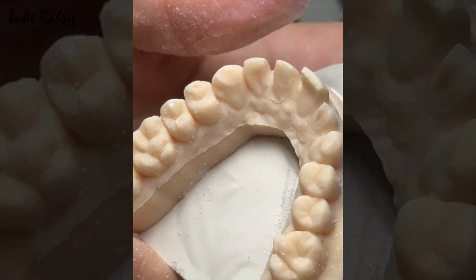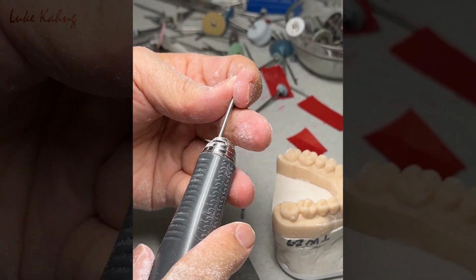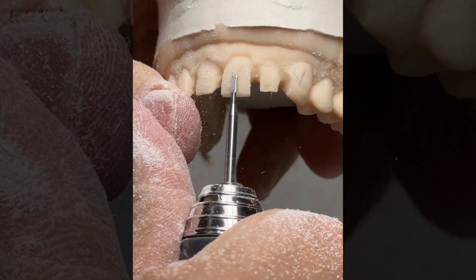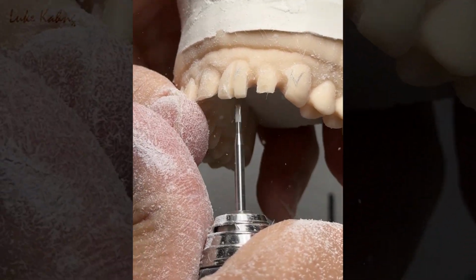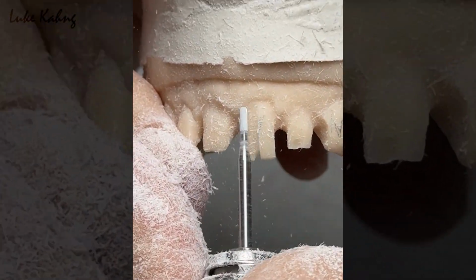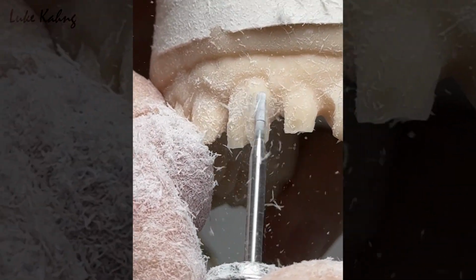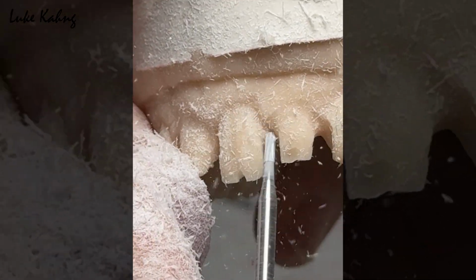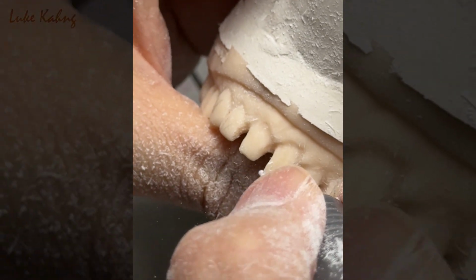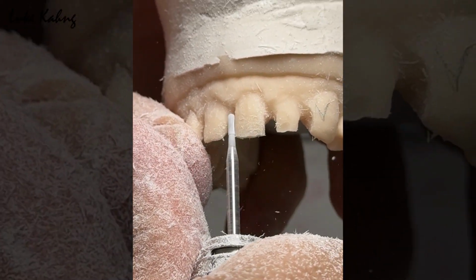Now, this is the veneer. Go to veneer. They have to look at the internal color, what the internal color looks like. If they think it's too dark, I need more preparation from the inside. Millimeter reduction because this is too long. Just a little bit more grinding facially.